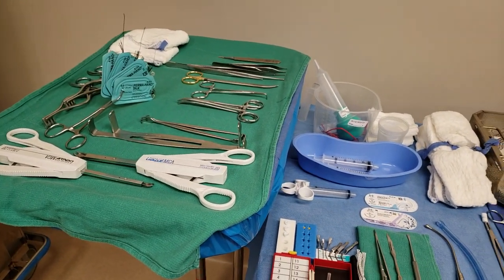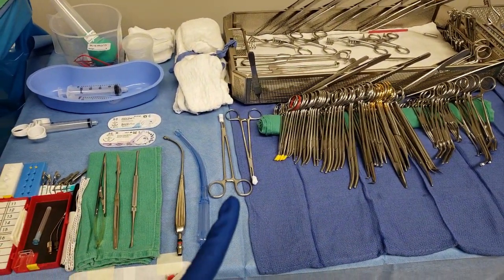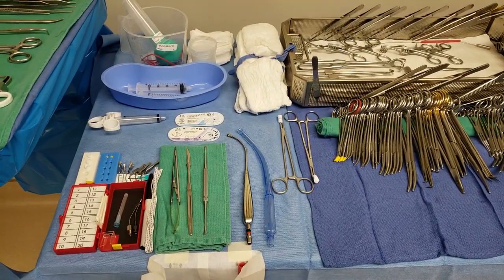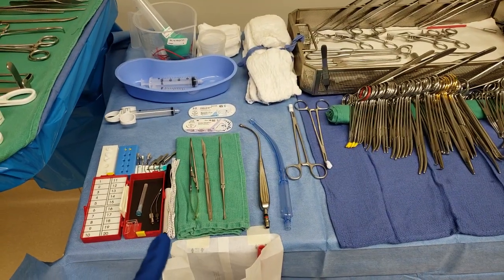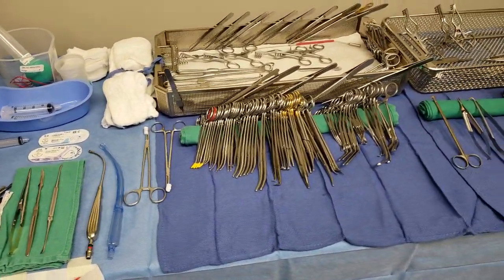For example, these are called kitners — these are for dissection. Some surgeons use them; I don't know if he does or doesn't, but I opened it anyway. I also opened some umbilical tapes — it does say that on his preference card, so I went ahead and opened that.